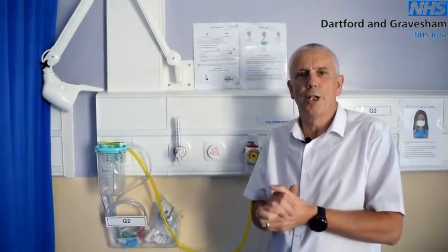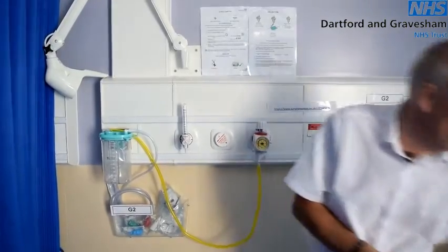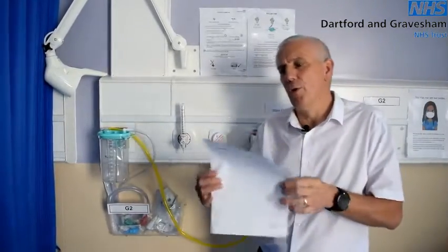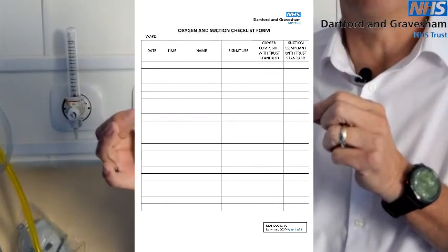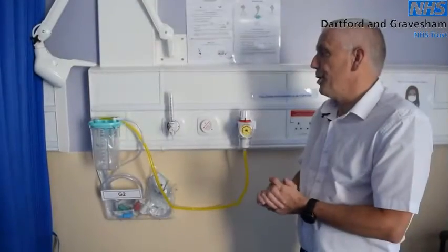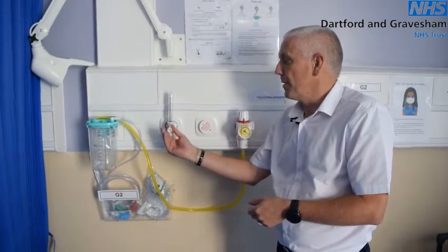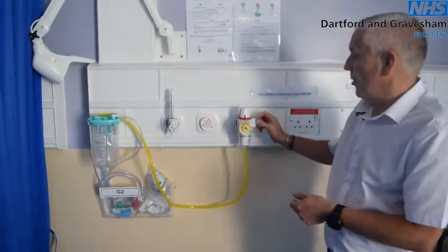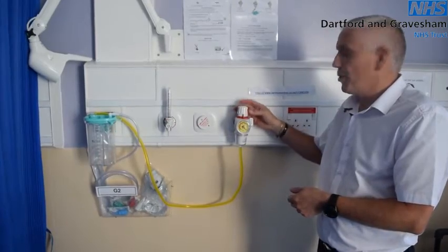Why should you test your suction and oxygen therapy daily? It's a requirement to meet CQC regulations. You should also find somewhere on your ward a checklist, which should be signed daily and be made available for inspection at any time. When these units are not in use they should always be fully turned off — oxygen should be turned fully to the right, and on the suction unit the on/off tap should be on off and the dial on zero.